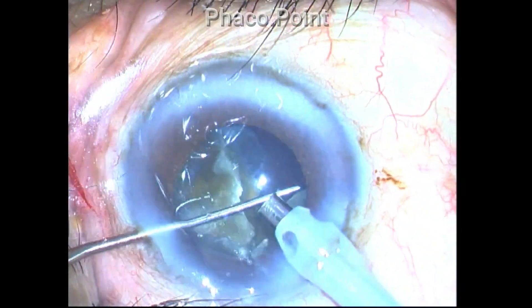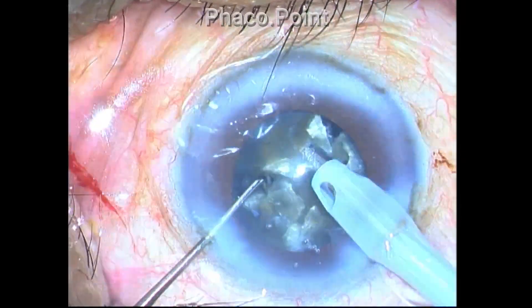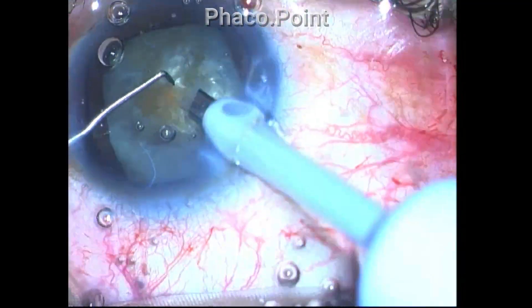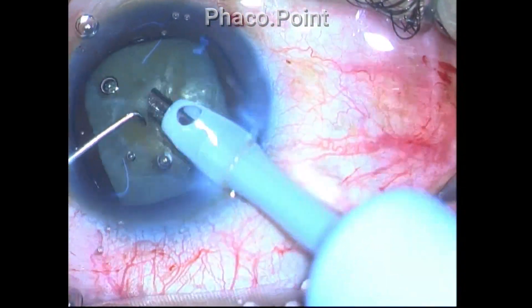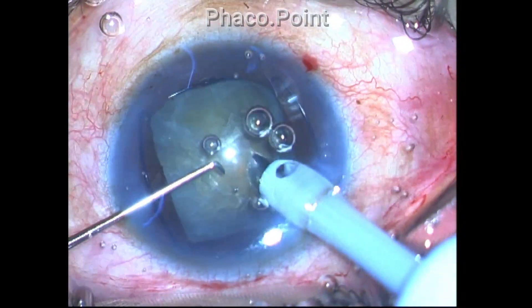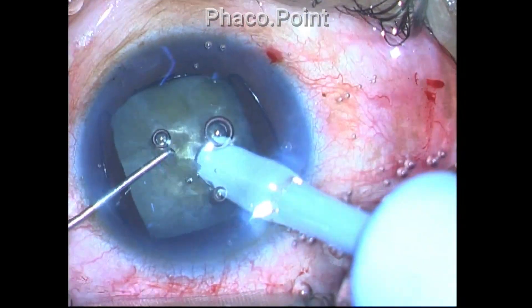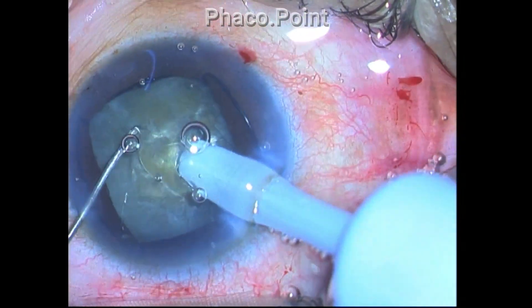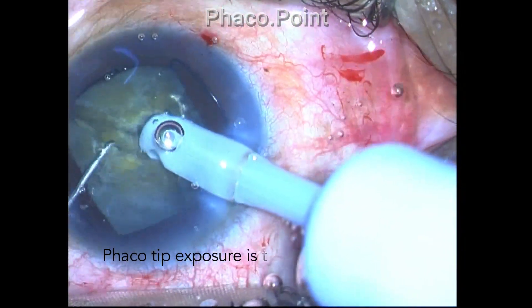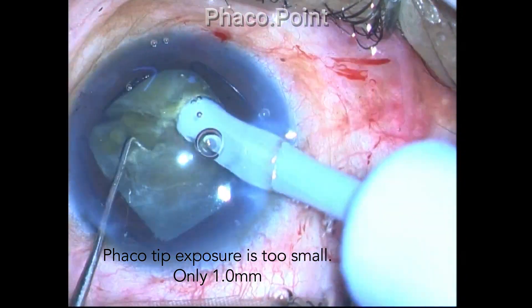Once you have created sufficient fragments, removal is quite simple — use the correct amount of phaco power and aspiration flow rate to emulsify the fragments. In a pretty hard cataract, to get an instant occlusion you generally bury the phaco tip with the bevel-down position, and the place of impalement should be just above the midpoint. Even doing everything correctly, a through-and-through crack may fail if the phaco tip is not exposed sufficiently.